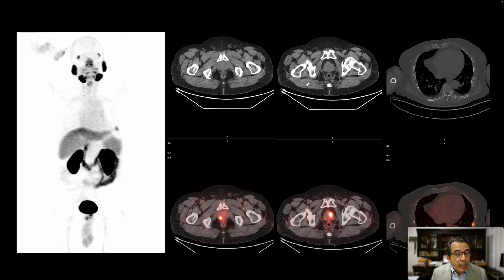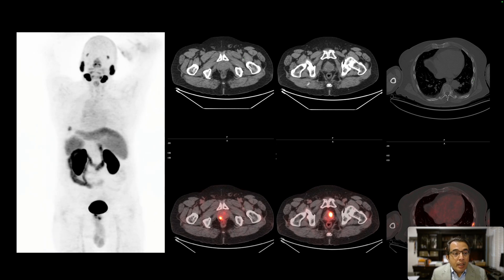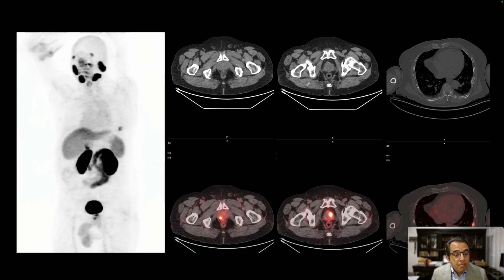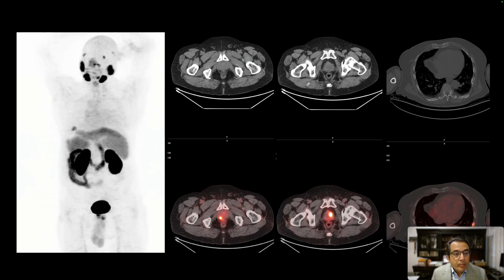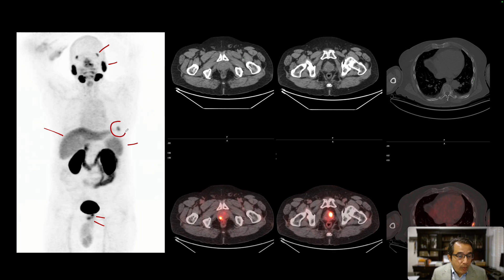Here's our next patient. They were diagnosed with prostate cancer — multifocal in the prostate — and a PSMA PET-CT was performed for whole-body staging. The rotating image shows characteristic physiologic uptake in the lacrimals, salivary glands, liver, spleen, and multiple foci in the prostate. There is also a rib focus in one of the left-sided ribs.